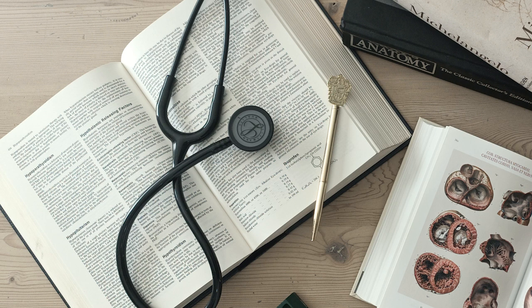You can't rely on your usual ST segment rules. Specific criteria like Sgarbossa criteria exist but are complex. Treat it as an MI until proven otherwise. Okay, LBBB with chest pain always demands an emergency workup. What's the second important clinical circumstance?